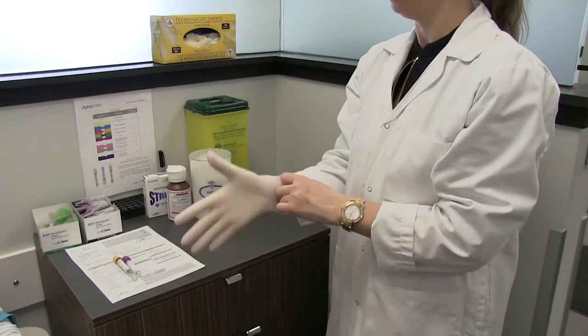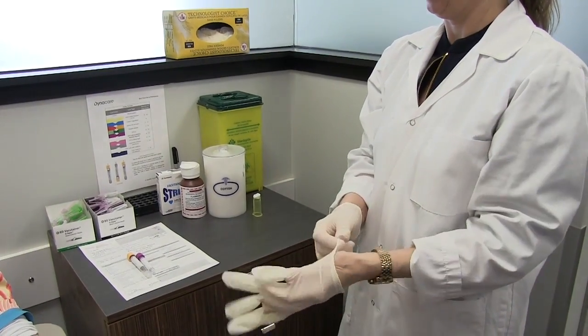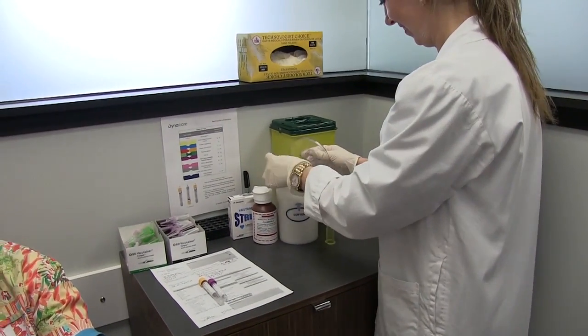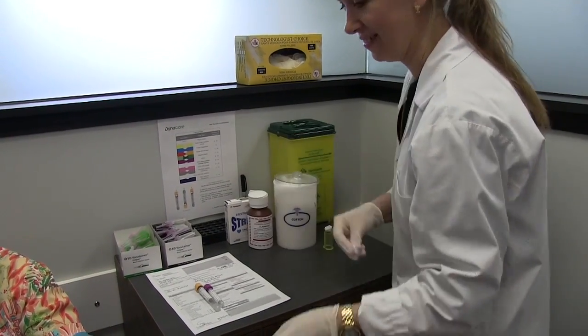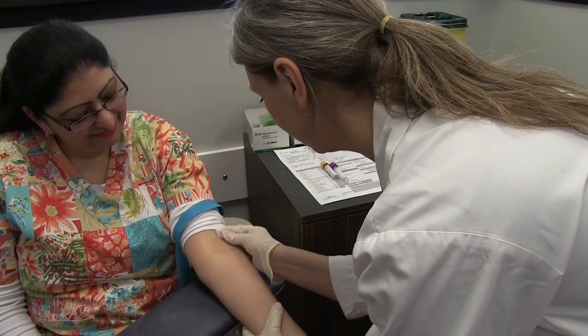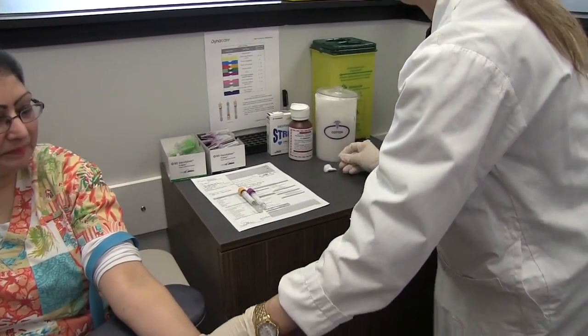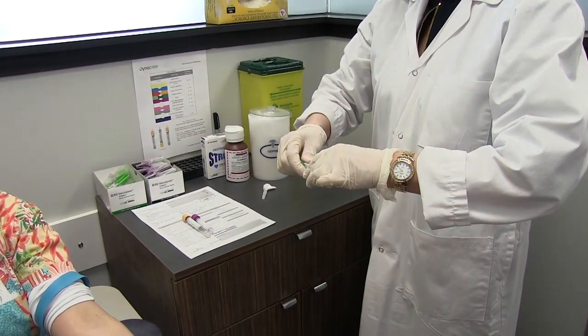Put your gloves on for the collection. Using the cotton ball, cleanse the site with 70% alcohol in a circular motion. Start at the middle of the site and move outward. Allow the alcohol to air dry for 30 to 60 seconds. Select the appropriate needle gauge based on the size of the vein and make sure all connections are secure.